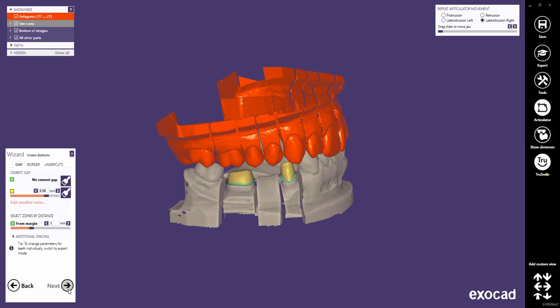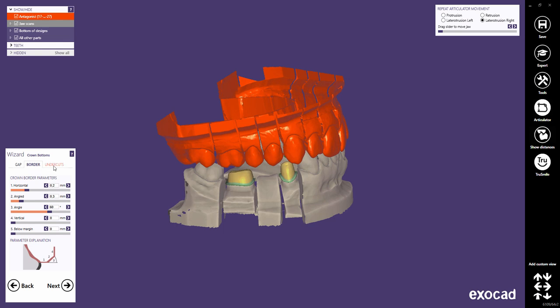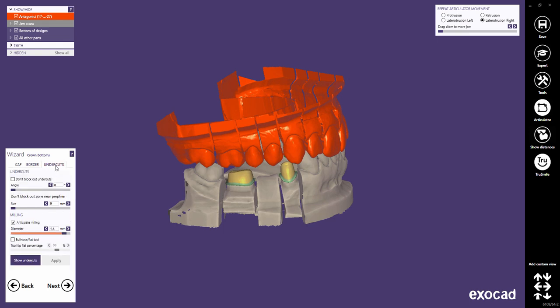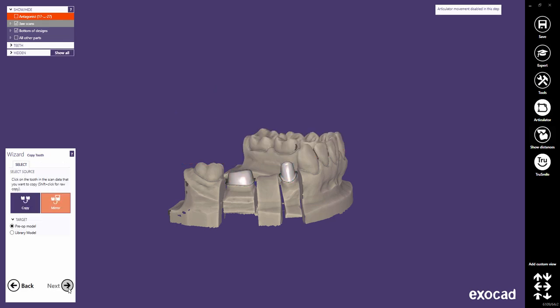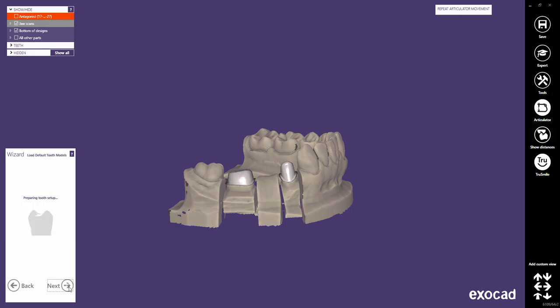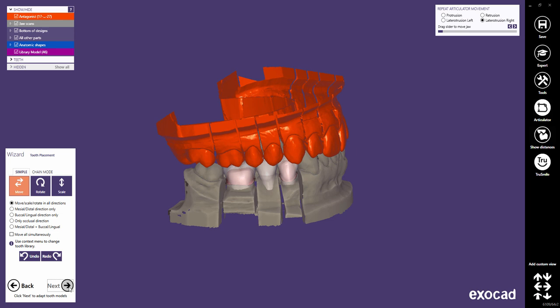The Crown Bottom Step allows you to design the inside of the crown. This part of the design and the parameters involved are crucial for a proper fitting. This step, including border and undercut settings, will be explained in more detail in a separate tutorial. Click the Next button to proceed to the next step. The Copy Tooth Step allows you to use copies of existing teeth as library teeth or pre-op models. This will be explained in a separate tutorial. Let's proceed to the next step, which is the tooth placement.